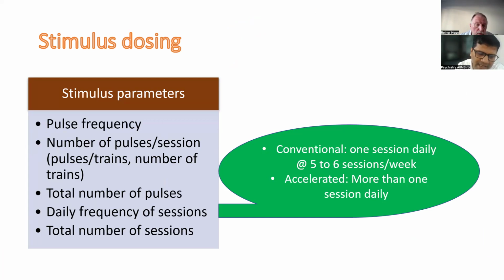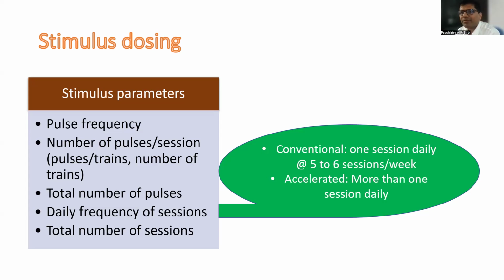Very recently, the Stanford protocol, that is the SAINT protocol, was approved in 2020. It allows you to give around 10 sessions in a given day, and a total of 50 sessions over a period of 5 days. It is found to be quite safe and is US FDA approved. So an accelerated protocol can go up to 10 sessions in a given day.